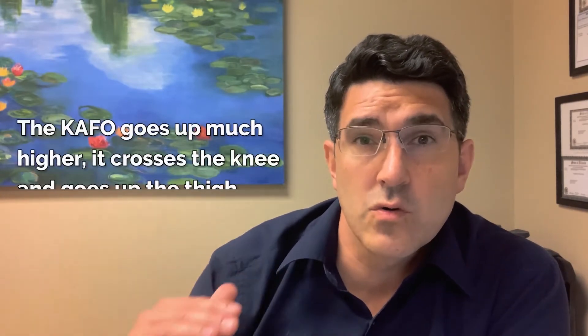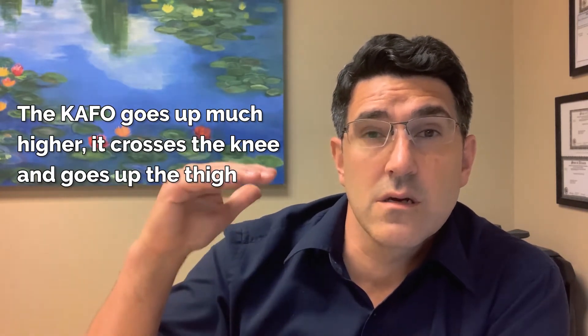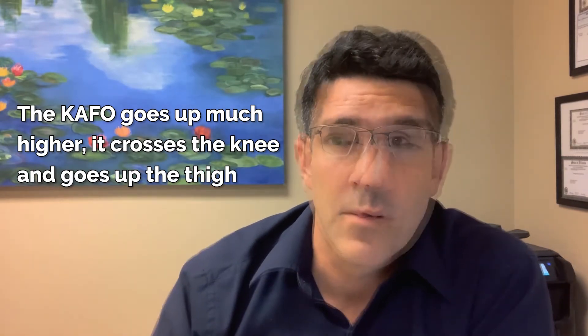The main difference between an AFO and a K-AFO is that the K-AFO goes up much higher, crosses the knee, and goes up the thigh. Much bigger brace. I've seen them work great, and I've seen them be cumbersome for someone who struggles with bigger braces. So it can go both ways. I'm a big believer in them actually, but it has to be for the right patient.